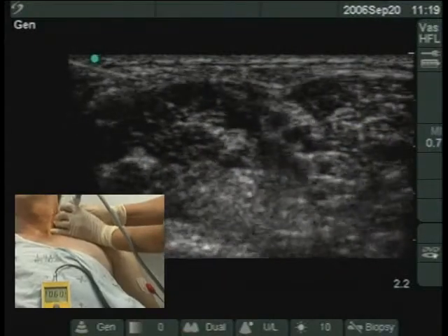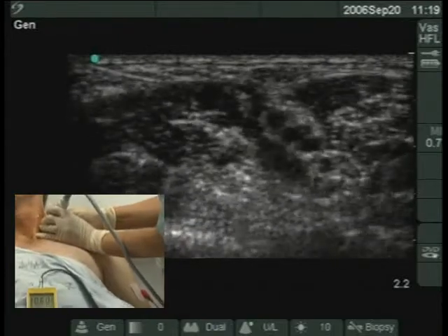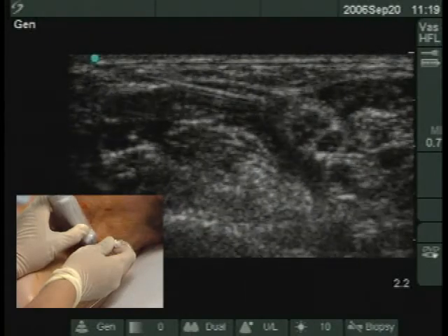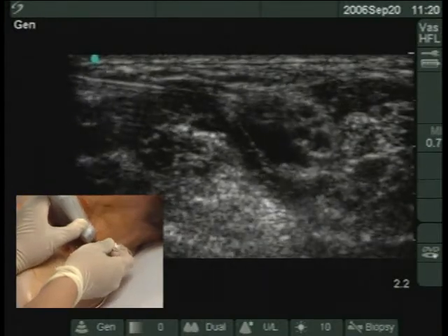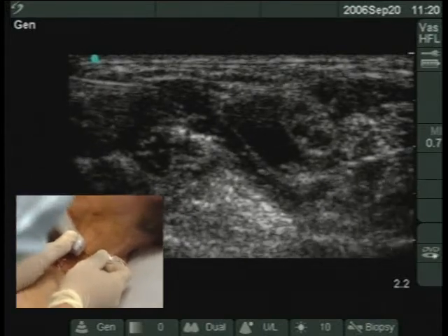On contacting the most superficial neural structure, one can see deltoid and/or biceps muscle contractions. The nerve stimulator is stopped and one can see the needle-nerve interaction as the needle tip is moved slightly back and forth. At this point, one milliliter of local anesthetic is injected; this should cause no pain and there should be no resistance to injection.